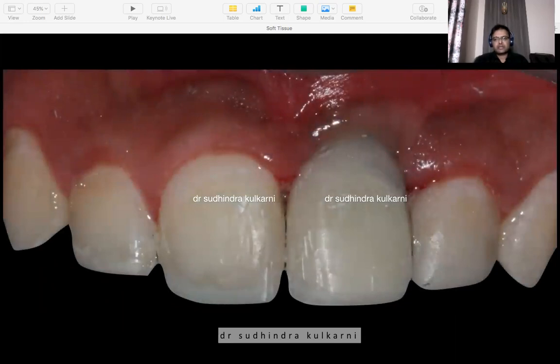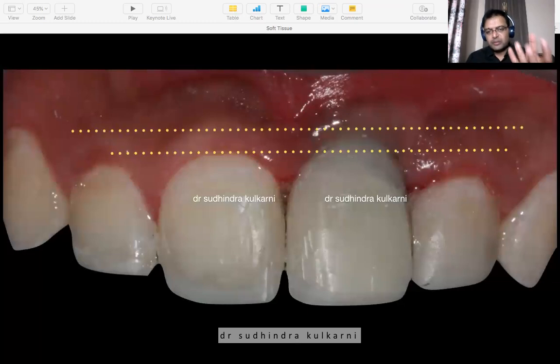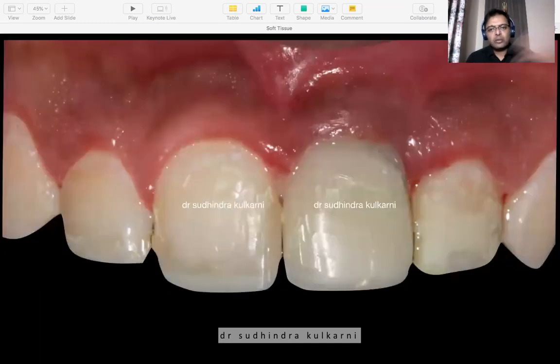What's a dynamic compression technique? It's a technique where you take the temporary and you push it, remember this word, dynamic compression. So you take the temporary, you push the soft tissue against it, wait for 3 days, not more than that, wait for 3 days, and you remove the temp and you under-contour it. Due to the pressure, the inflammatory process that is set in due to the pressure will start reacting and you start getting a highly fibrous overgrowth.